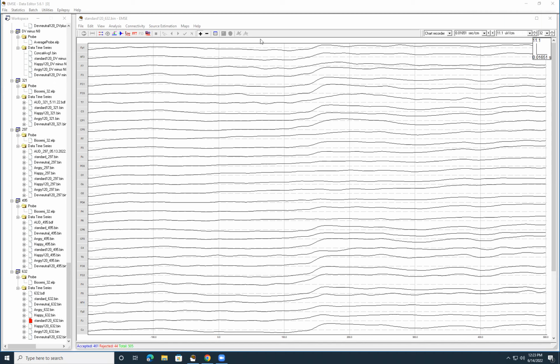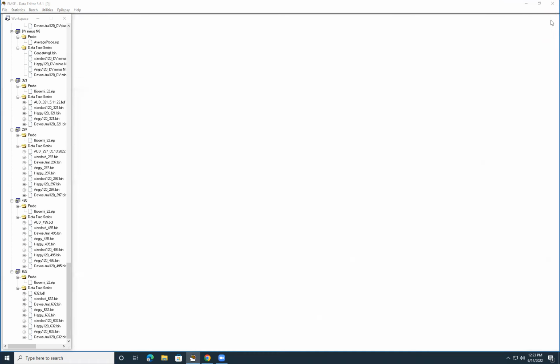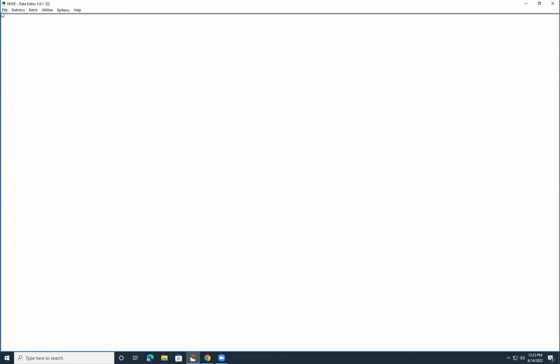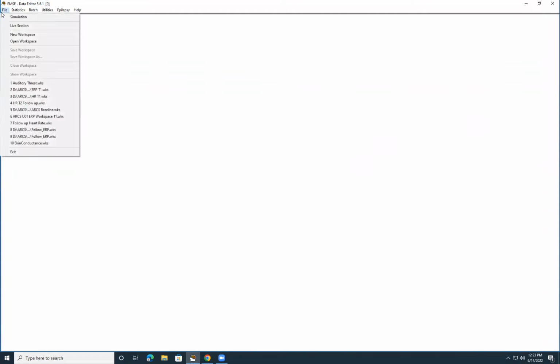All right, today we're going to be talking about brains and voices. There's a couple things that we realized we should discuss. First is just the general processing of brains and voices participants. And we're going to do the whole thing from the top and then talk about some important details too that might come up as necessary information for a poster or a paper.